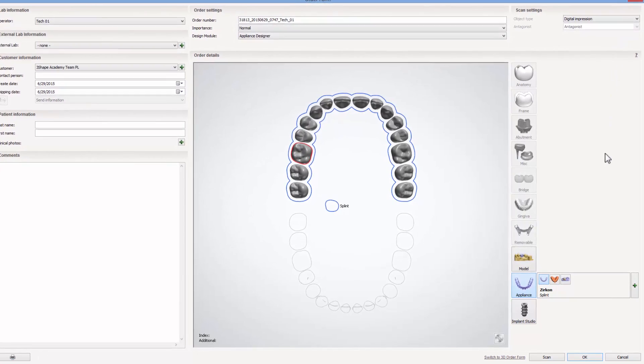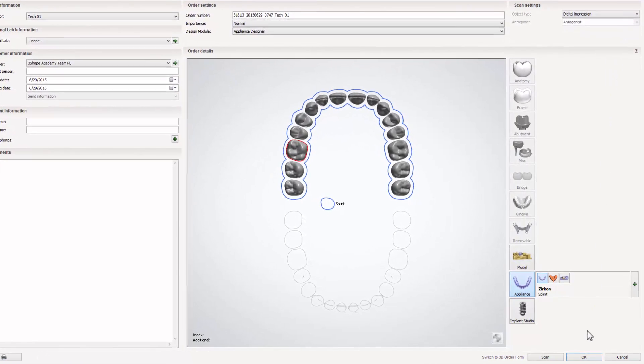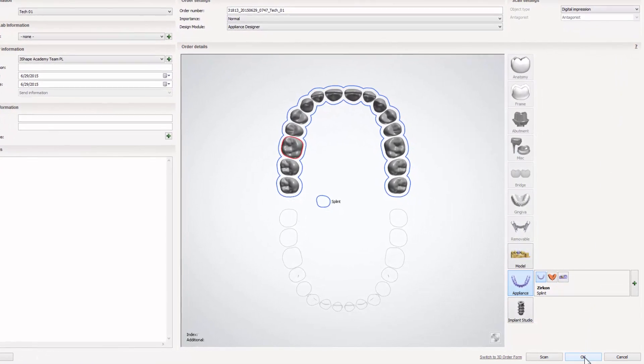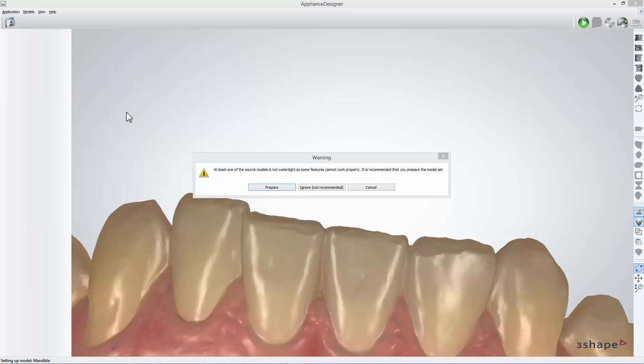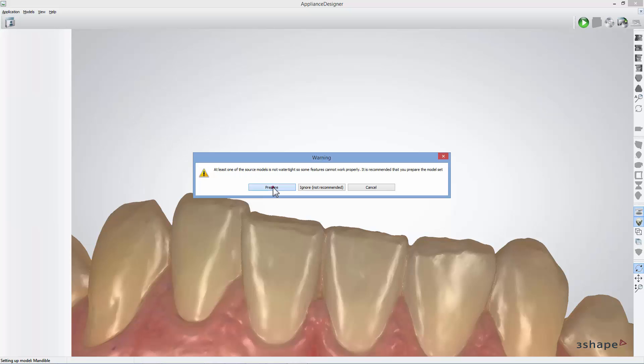When new order is ready you can open the digital impression. While doing that, appliance designer will ask you to prepare the intra-oral scans. Click prepare.